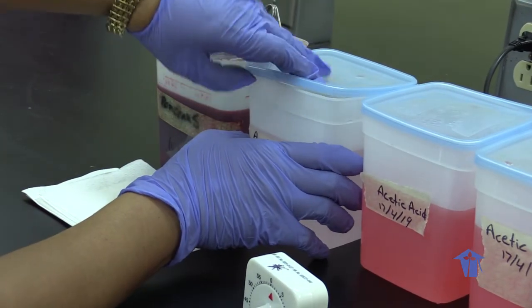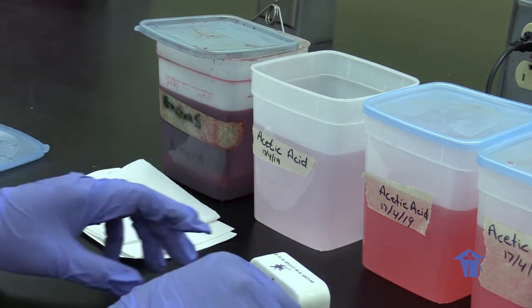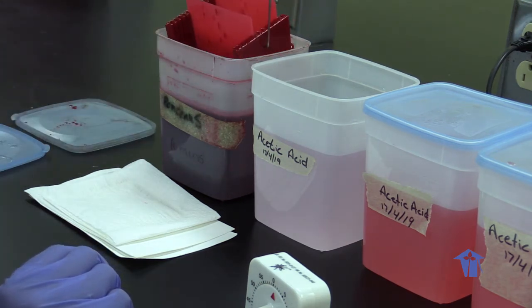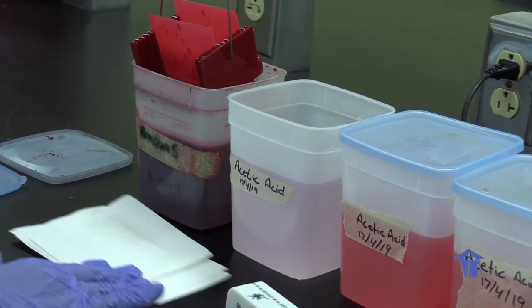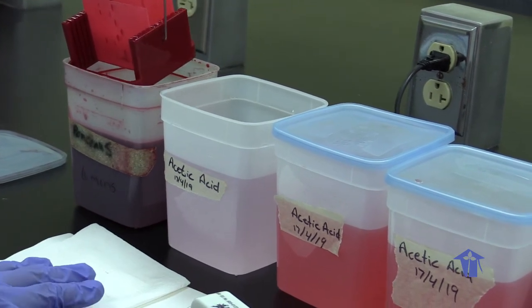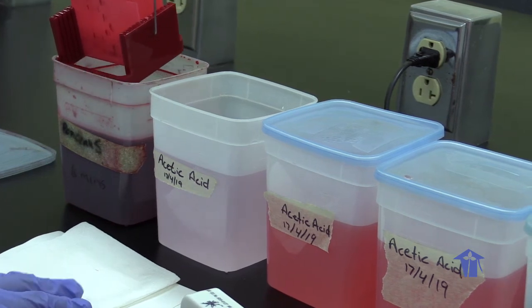Right, so class, it's about time. So from this, after the stain, we're going to the acetic acid. 3 stations of that, 2 minutes each, and that part of the staining procedure is to de-stain.